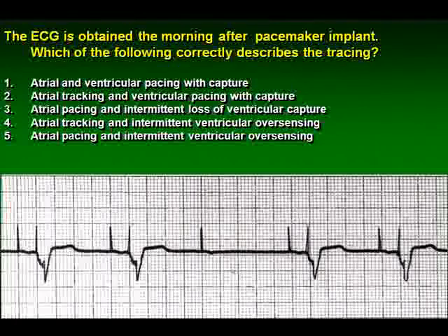Okay. Well, atrial spike, ventricular spike, P wave, QRS, atrial capture, ventricular capture. Atrial spike, capture, ventricular spike, capture. Atrial spike, capture, there's a P wave there. No ventricular spike, so the ventricular spike is inhibited. Why would it be inhibited? Because it senses something. Then we go back here.